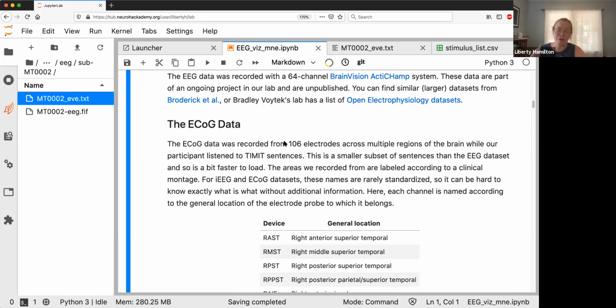They've tried a number of things, and so they're looking for a way to localize seizures in the brain. And if it is so, a neurosurgeon may resect that area of the brain. Of course, they like to check first to make sure that the person would not have any potential problems with speech function or with motor function if that were to occur. So there's lots of other testing, including scalp EEG, MEG and fMRI, that in my experience have been helpful in making those sorts of determinations.